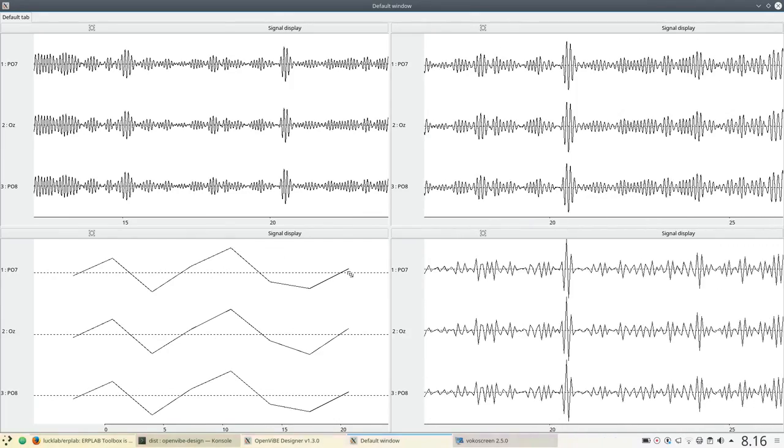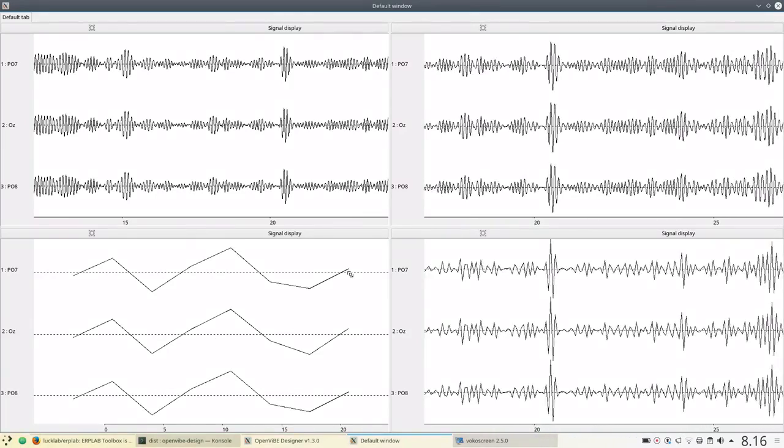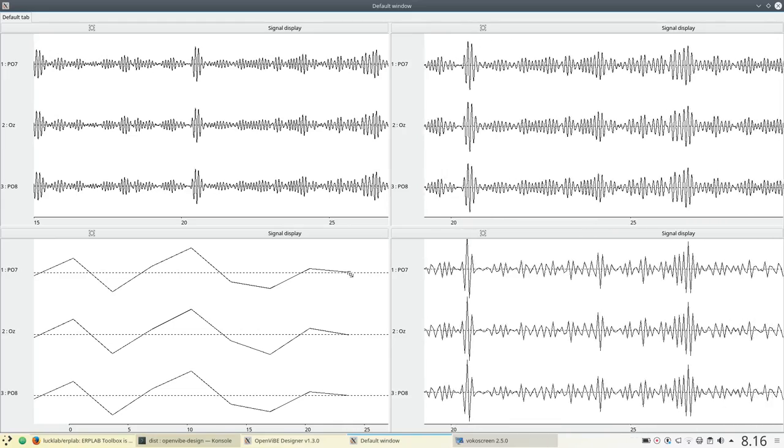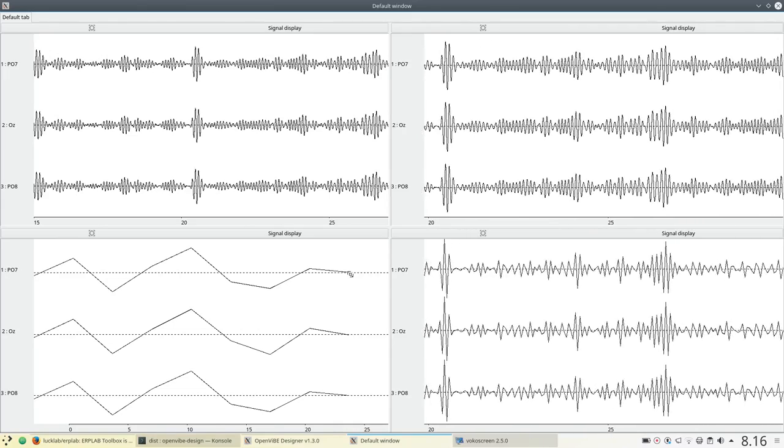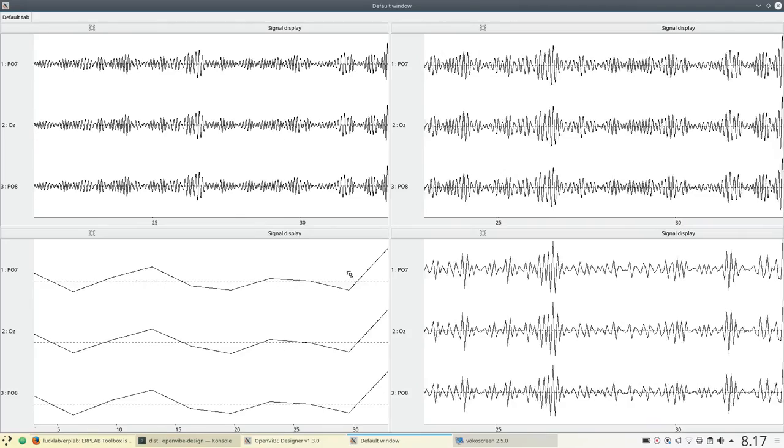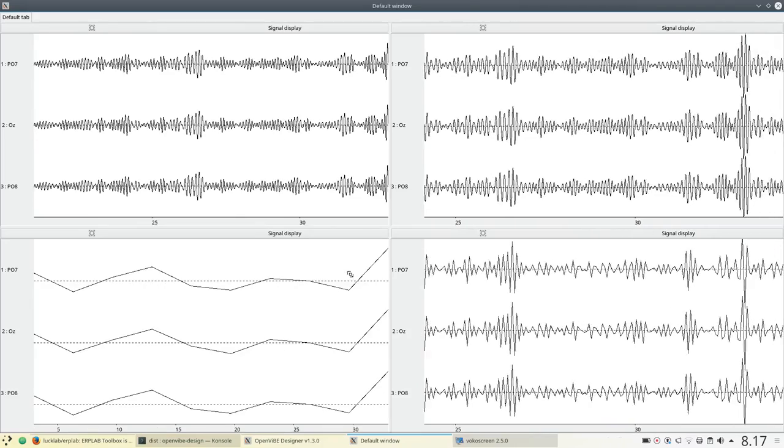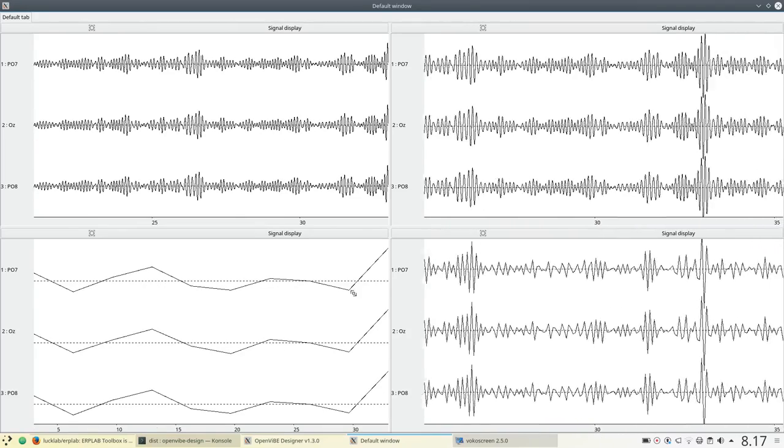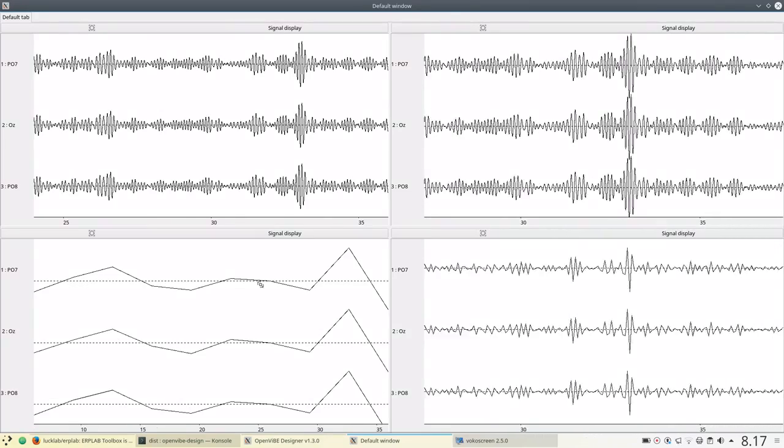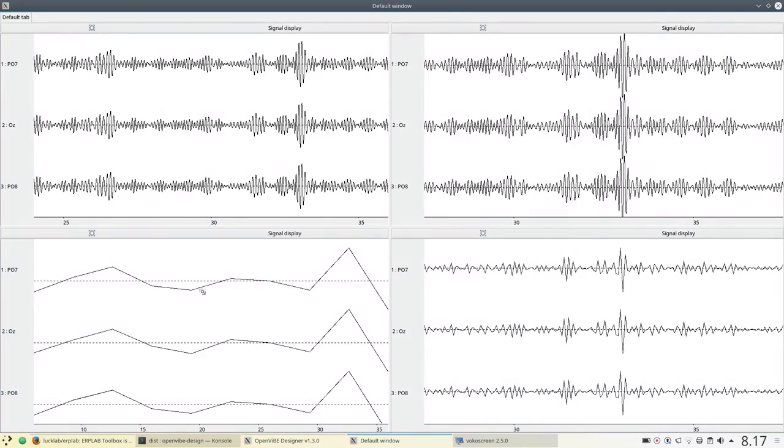What it's doing here with the averaging is taking that whole epoch, which is in this scenario three seconds, and finding the average value for all the data in that. So we're only having, in this sense, one point for every three seconds of data.